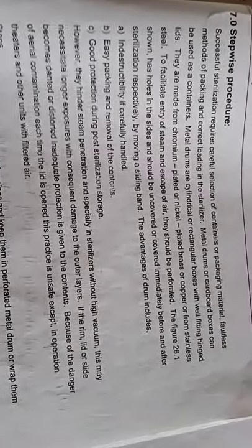These stainless steel metal drums facilitate the entry of steam and escape of air — they should be perforated. As already shown in the figure, perforations are present in the metal drum. These holes should be uncovered and covered immediately before and after sterilization respectively, by moving the sliding band.